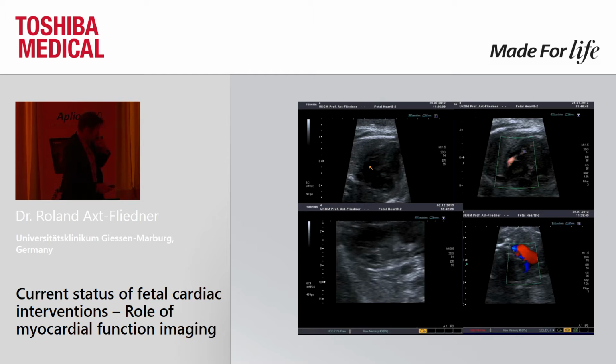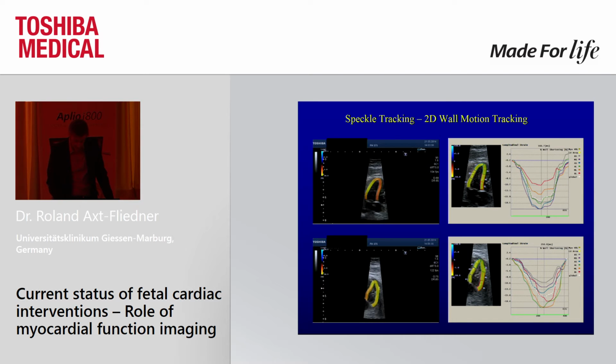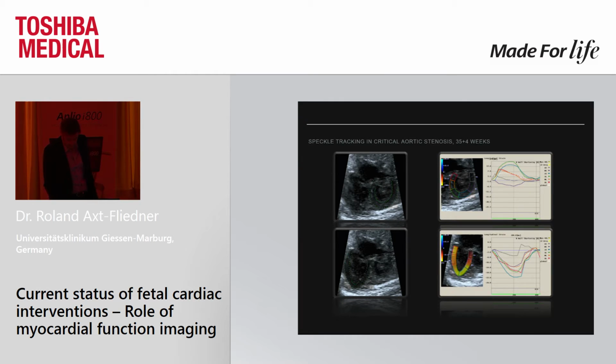and this might again increase the ejection volume ejected by the left ventricle, and then again antegrade flow in those cases. And this has been reported by Rajcik, and we perform those tests again in those cases, and it works. And there, speckle tracking might also be of interest, because you might see differences before the intervention and after the intervention.